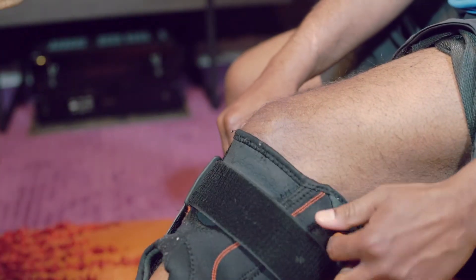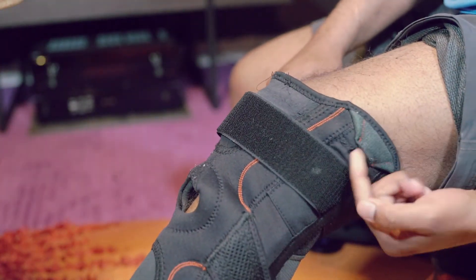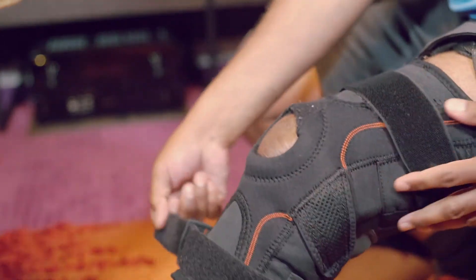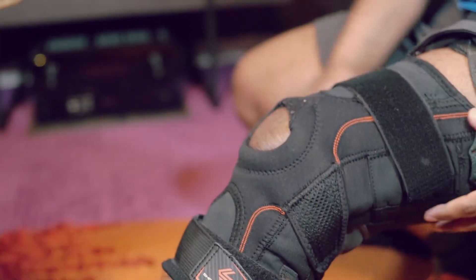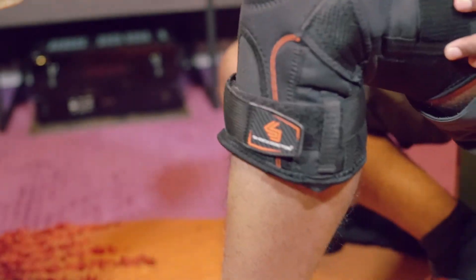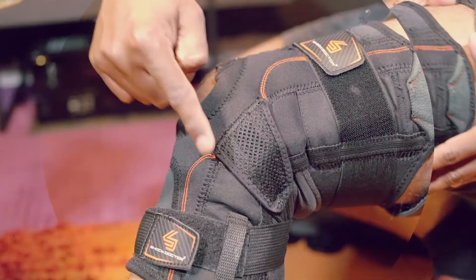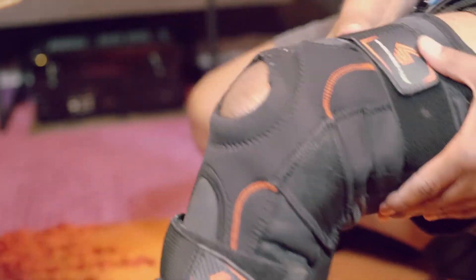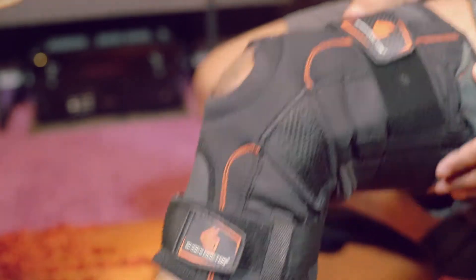Let's try this on. These finger tabs offer easy grip — pull when fitting. These metal hinges on both sides really help supporting the knee, and I can feel the difference while wearing it.